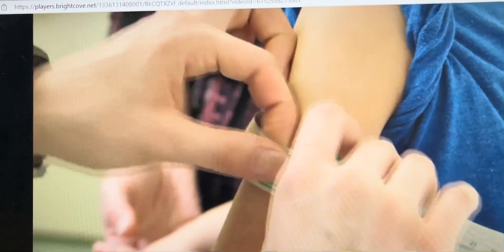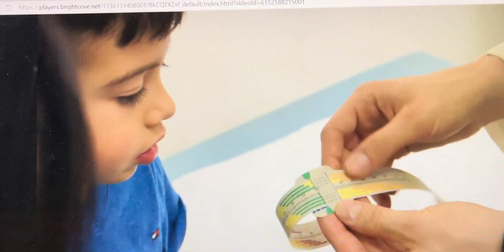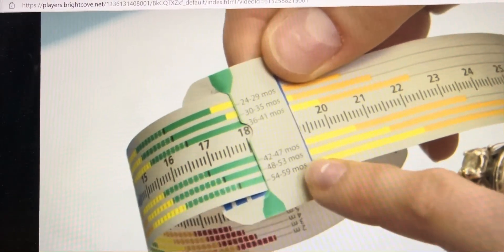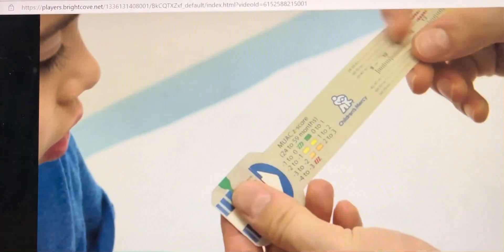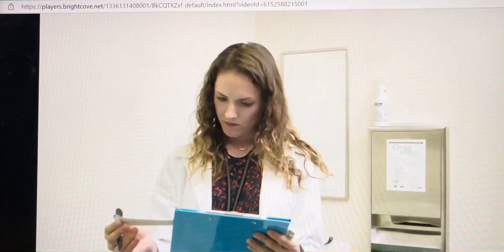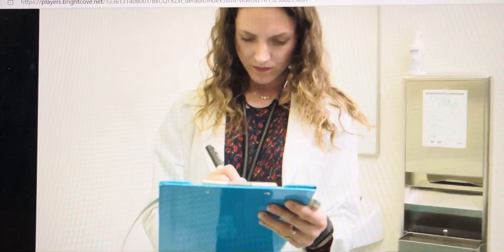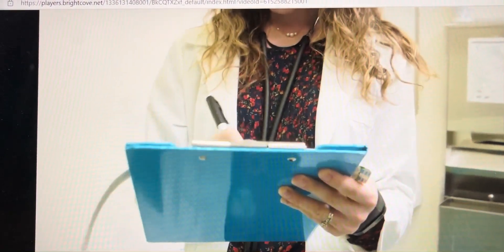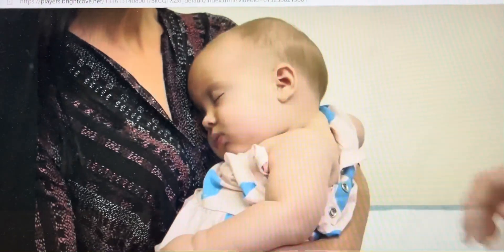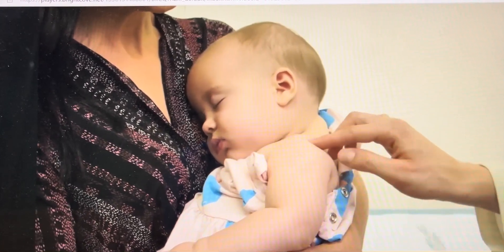Identify the color band corresponding to the age of the patient. In this example, the MUAC is 18 centimeters. Note the reading within the nearest 0.1 centimeter or 1 millimeter and the corresponding Z-score, color, and pattern. Record the measure in the patient's chart including the arm used, the measurement in centimeters, and the corresponding Z-score.